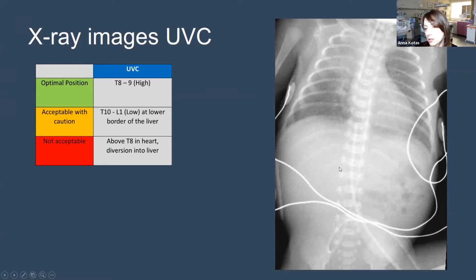Then how do you determine which vertebral level the catheters are lying at? So the best way to do it is count from the lowest rib and also from the uppermost rib. So it looks here on this x-ray like this is probably rib number 12, which would make this vertebral level T12. So we count up 12, 11, 10, 9, 8, 7, 6, 5, 4, 3, 2, 1.